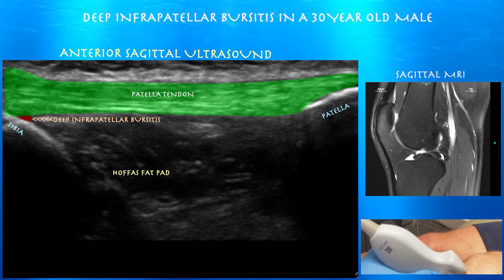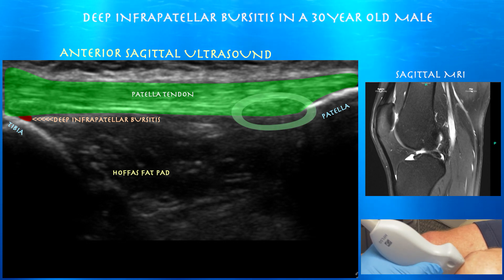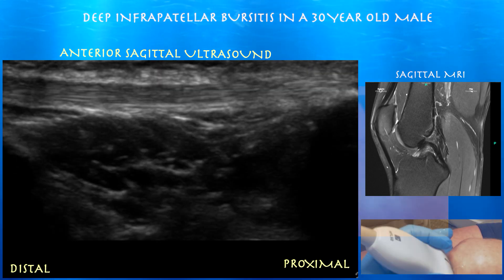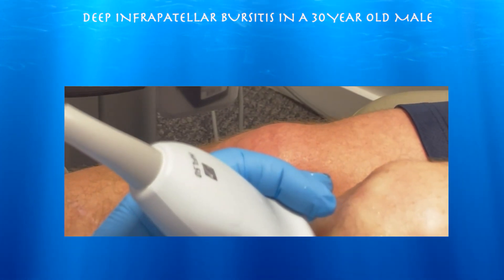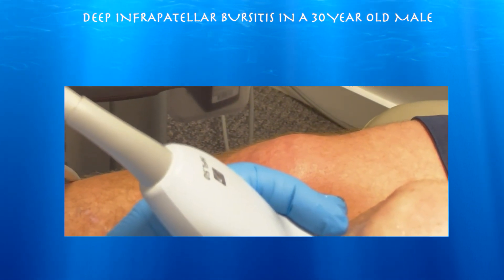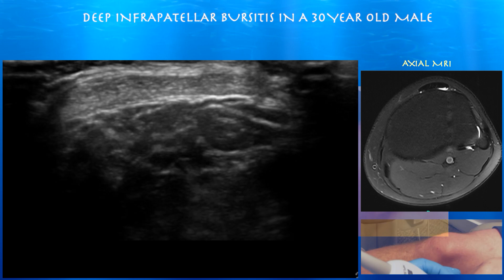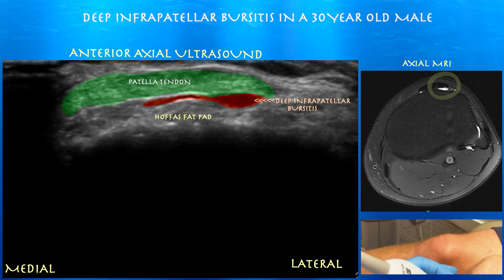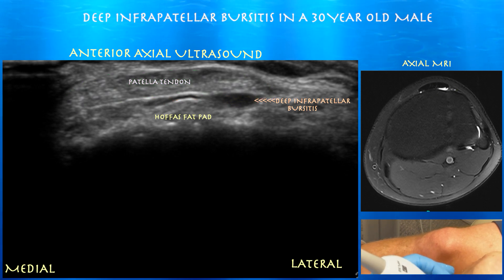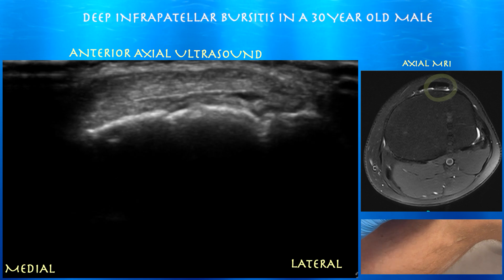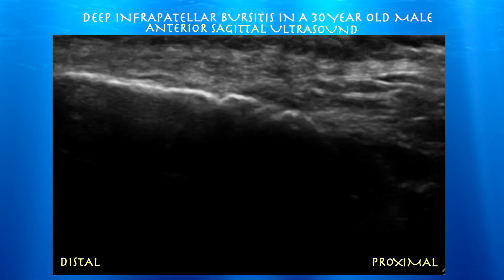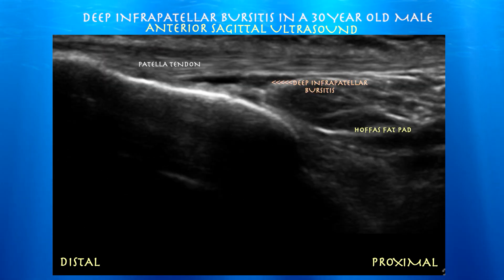It may have a touch of thickening by the proximal patella tendon — maybe a touch of tendinosis, but I'm not very impressed by it. Now at 11:06, lateral is to the right of the screen. Moving distally and just looking at the patella tendon, you can see a little bit of bursal thickening and bursal fluid — that deep infrapatellar bursa essentially. It is compressible as well. Here in the sagittal view, on the lateral aspect of the patella tendon distally, you can see this deep infrapatellar bursa.